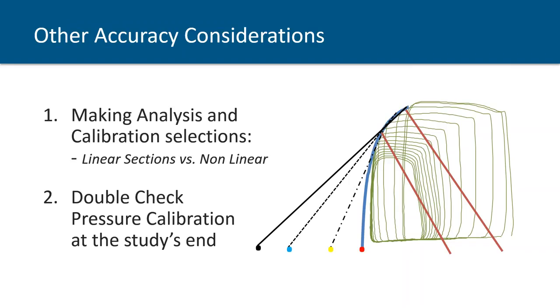If you're applying a linear fit, you need to adjust the range of data that you've collected so that it is essentially a linear data fit. You cannot use nonlinear points and apply a linear regression to that, because it becomes extremely variable which points are really driving that fit.